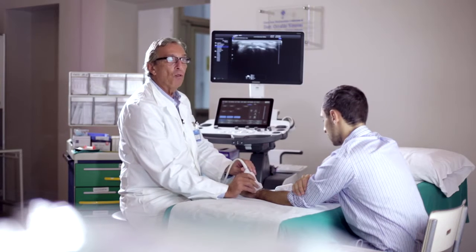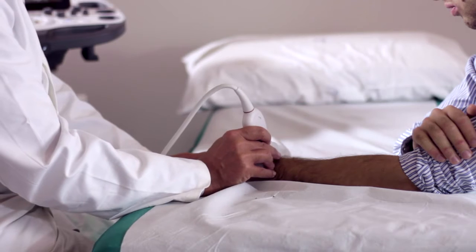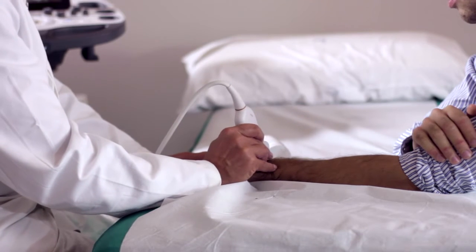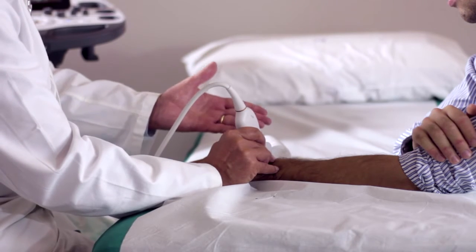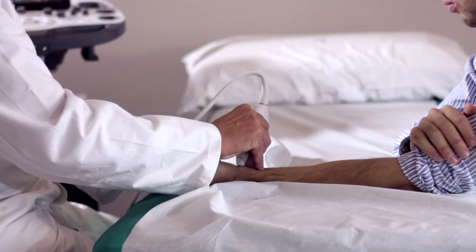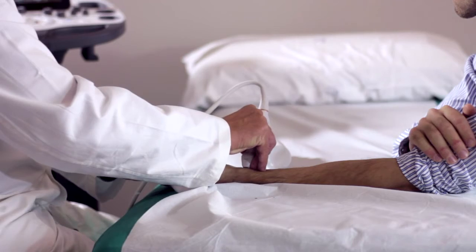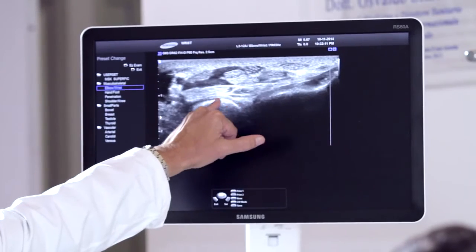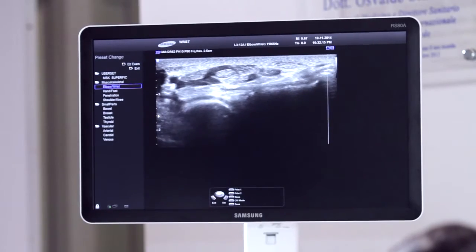Remember that more proximal scans will allow us to study another very important joint, the distal radio-ulnar joint. This joint can be studied with a dorsal, but also with a volar scan, to examine its osseous and articular components. This is a very specific scan that shows the distal epiphysis of the ulna, the distal epiphysis of the radius, and then the distal radio-ulnar joint.